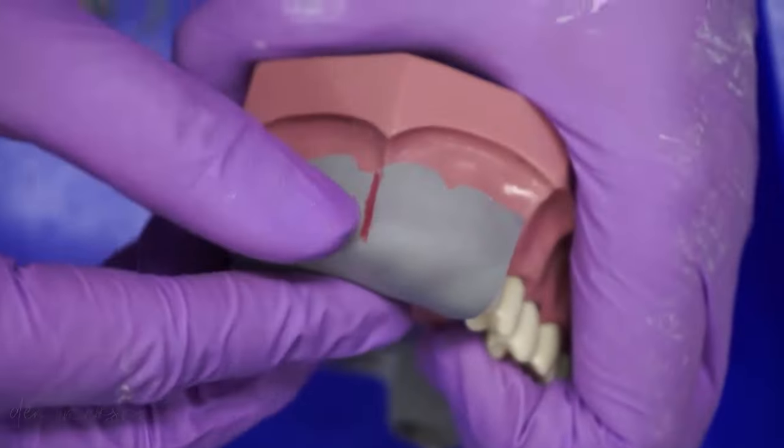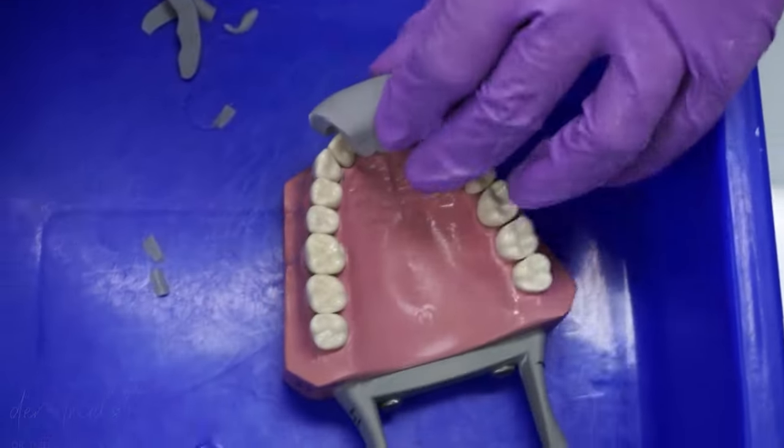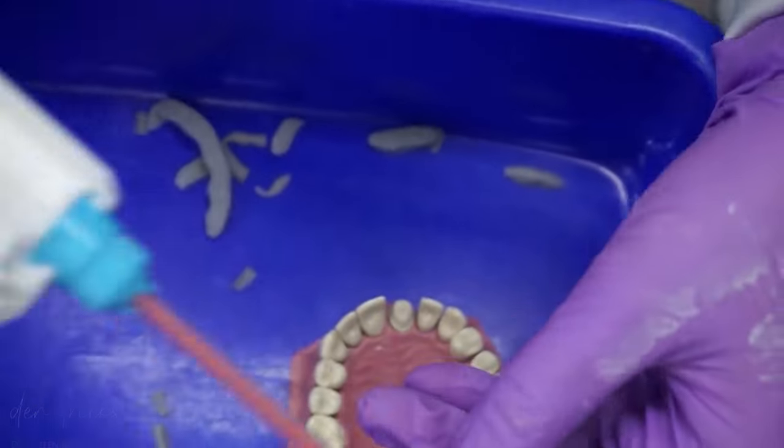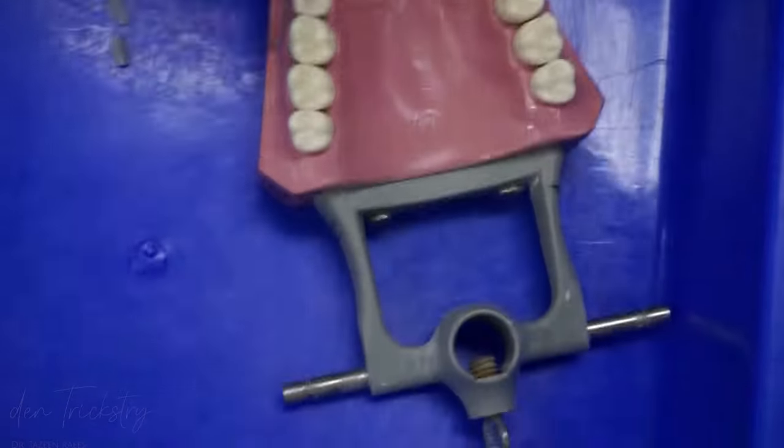Moving on, for the temporization itself or for making an immediate temporary crown, we use a self-cure temporization material. Here, I have used Dentsply Integrity in the shade A2. Before placing the material directly in the index, first confirm the position of the index intraorally.